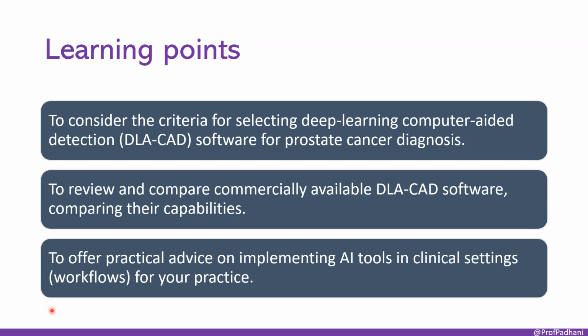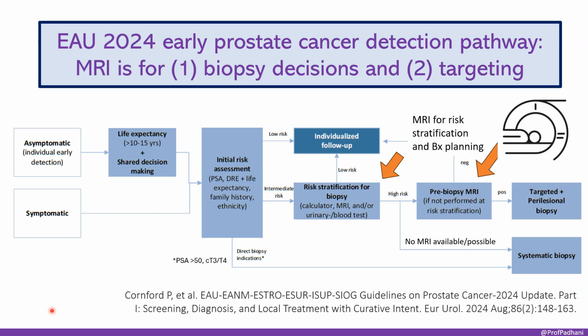Criteria for selecting this DLA-CAD software, that's deep learning algorithm computer-aided detection. Second, a look at the tools actually available commercially. And third, practical advice. How do you actually make this work in practice? Exactly. That's the goal. Okay, slide 4 jumps right into the guidelines.